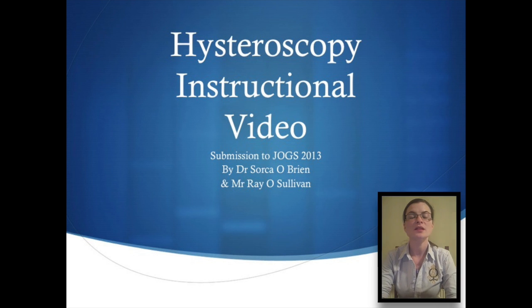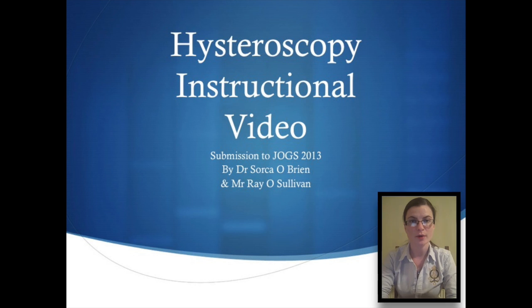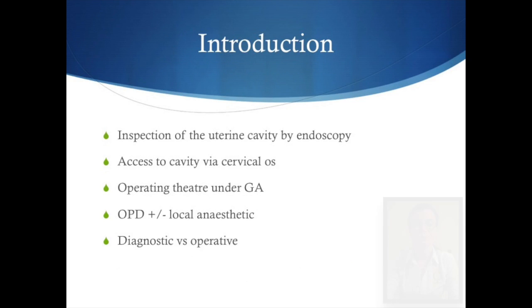This video aims to demonstrate the common procedure of hysteroscopy using a cheap reproducible uterine model and the vaginoscopic approach.